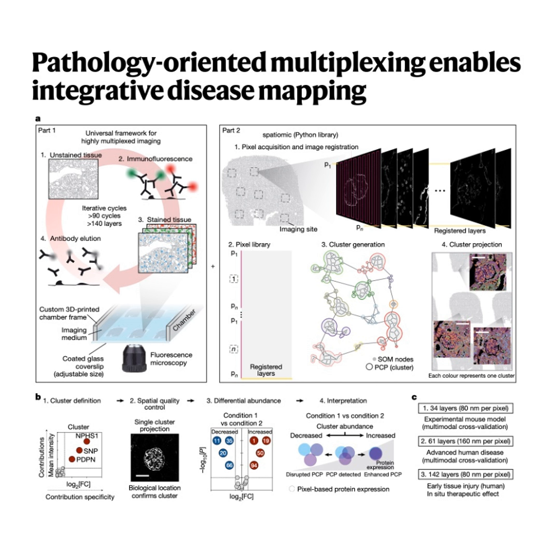And the key output, what it's really looking for, are these protein co-expression patterns. They call them clusters. Think of a cluster as a biological signature. It bundles together information about the cell's structure, where proteins are inside the cell domains, and even signaling activity all at once. So it's not just more detail, it's integrated detail. The breakthrough isn't just seeing 100 proteins instead of 30. Exactly. It's that PathoPlex defines disease based on this nanometer scale fingerprint, this cluster, that signals trouble before the whole cell looks obviously sick to standard methods.